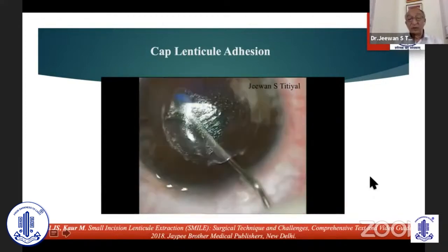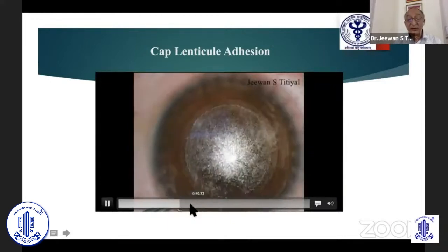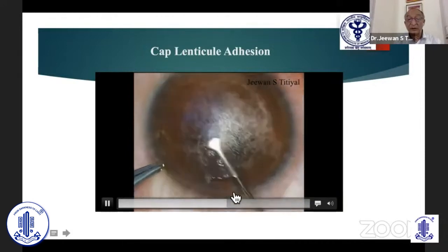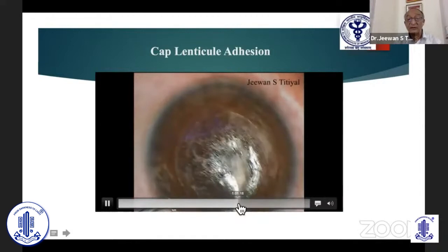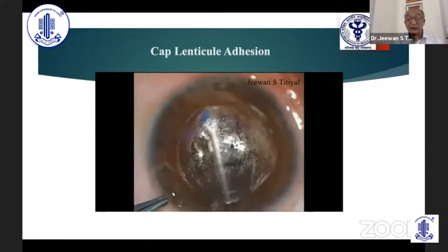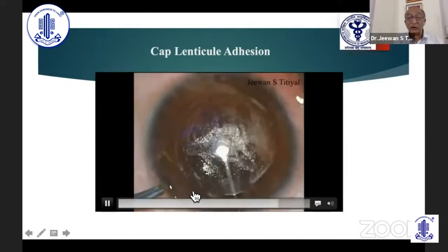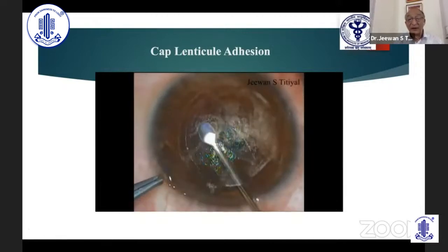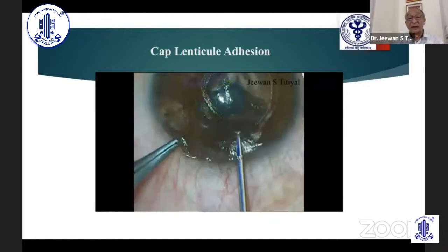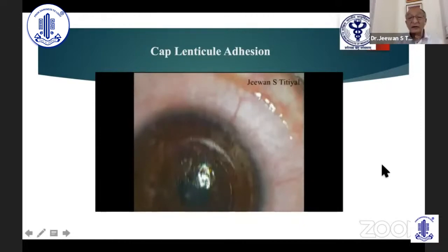Edge identification is so important. In another patient, I had a similar difficulty dissecting posteriorly because I had gone posteriorly directly. With a little bit of fluid present, it is very difficult. So I just did anterior dissection. Once I had done anterior dissection completely, I was still struggling to see the posterior dissection. But just observe the area — I already have an edge. So I just go anteriorly to that and push the entire lenticule towards the central area. Then I have a flap. Going anteriorly, the dissection can be delineated and the lenticule can be removed by rotation — like a capsulorhexis technique — and taken out.